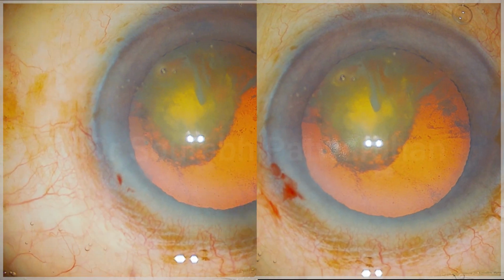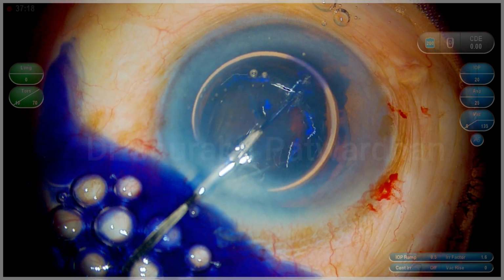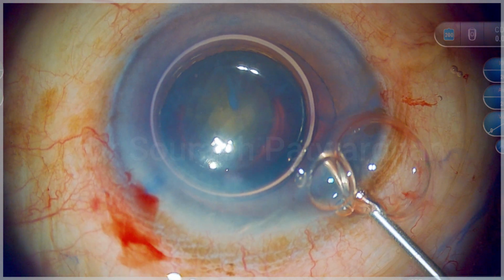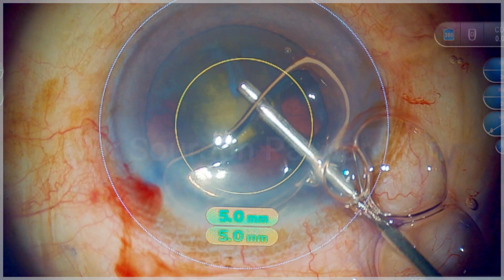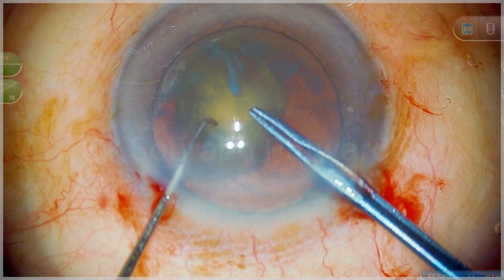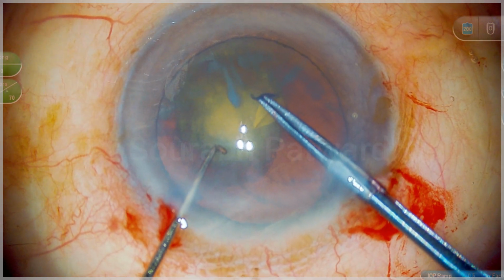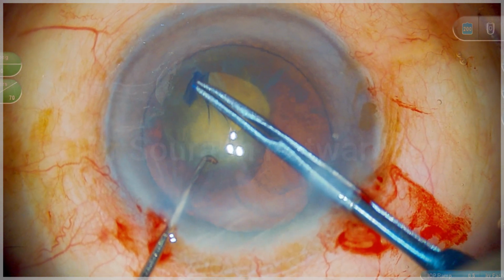This is an 81-year-old male and he gave a history that probably 35 years back he had shown to an ophthalmologist and he was advised against the surgery, probably because it was a posterior polar cataract and he was explained about the risk. So he left it as it is and now he has presented with further loss of vision. So I want to take care of this cataract now.